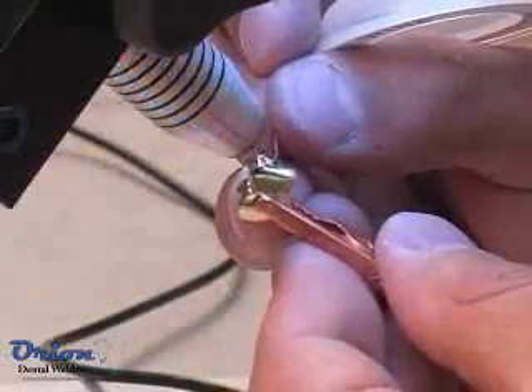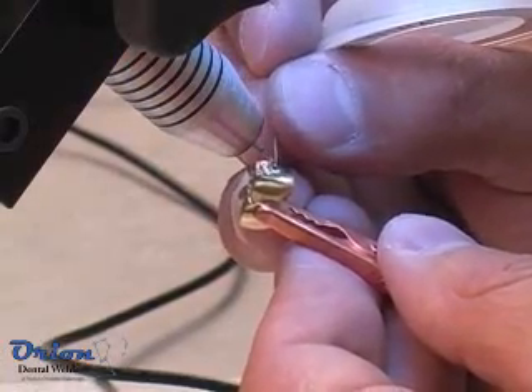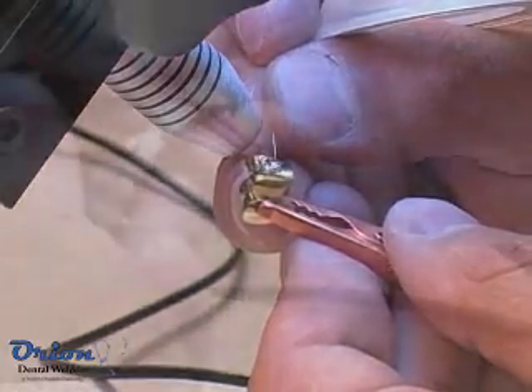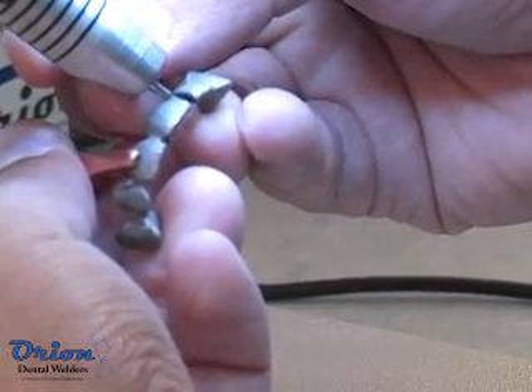Sometimes metals such as copper, platinum, and white gold are very sensitive to electrode preparation and condition. A clean and properly prepared electrode will produce a smooth and repeatable weld. However, an electrode that needs maintenance will produce a porous weld and weld energy may not repeat from weld to weld.